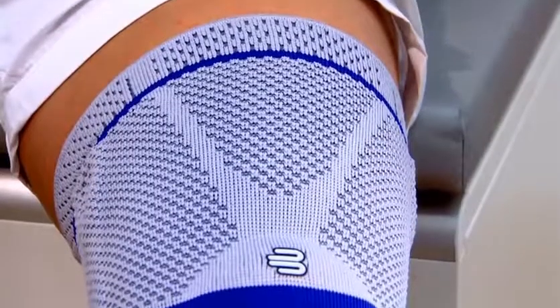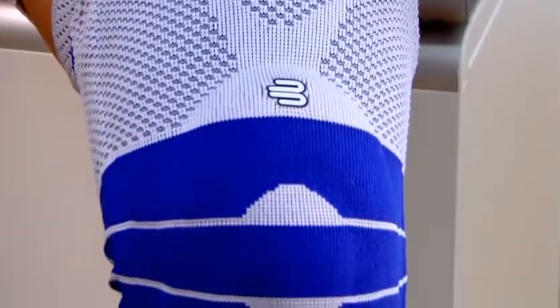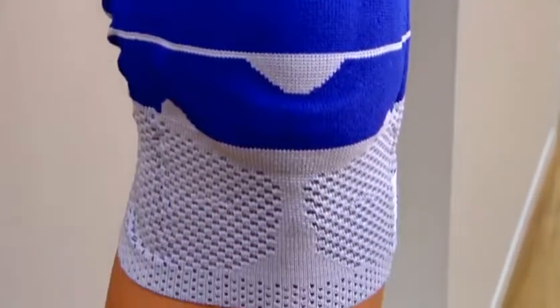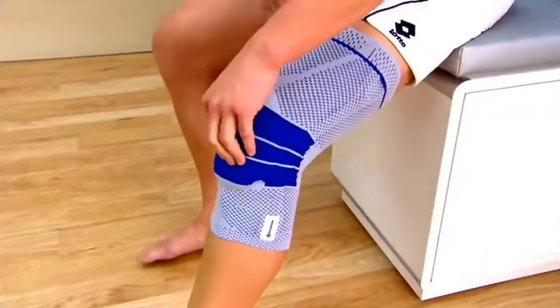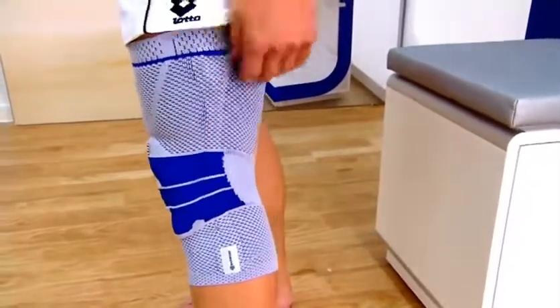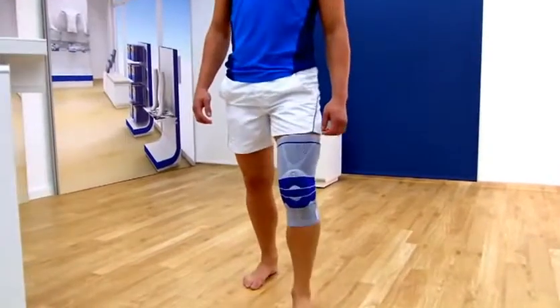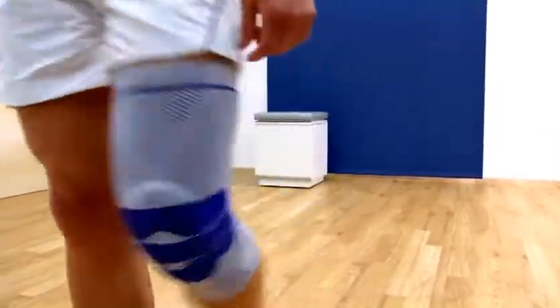The three-dimensional active knit is made from breathable material and produces a constant massage effect on the muscles during movement. It is recommended that you check the fit of the support within 30 minutes after putting it on. You can tell that the Genutrain fits correctly if the Omega Pad encloses the kneecap precisely.